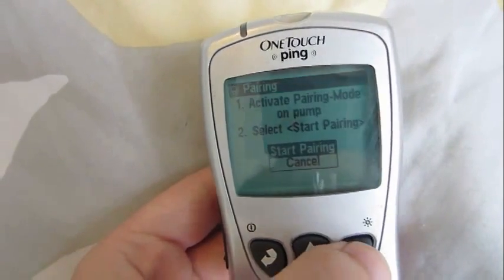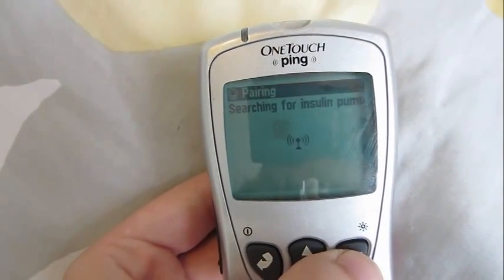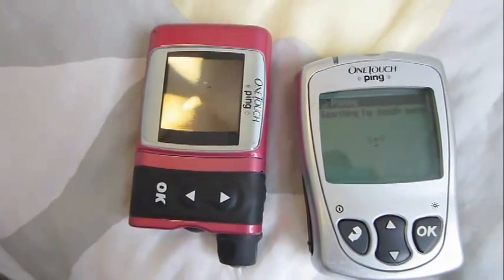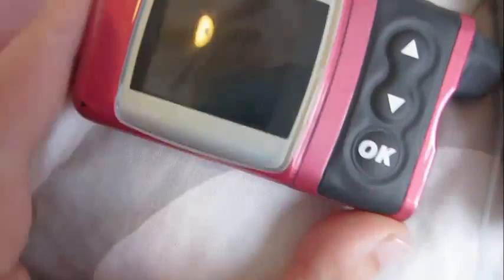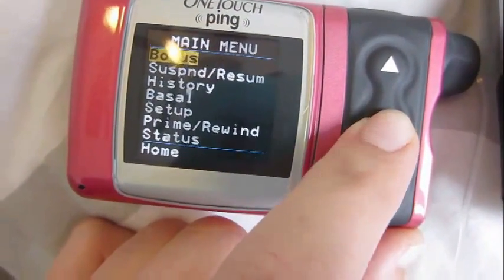Then you want to click start pairing — it's searching for my insulin pump. Here it is. Oh, it failed. That's great. Let's try again. I forgot I have to pair it on here too. Obviously I really know how to do this. Then go to your pump — and how do you do this? Hold on.